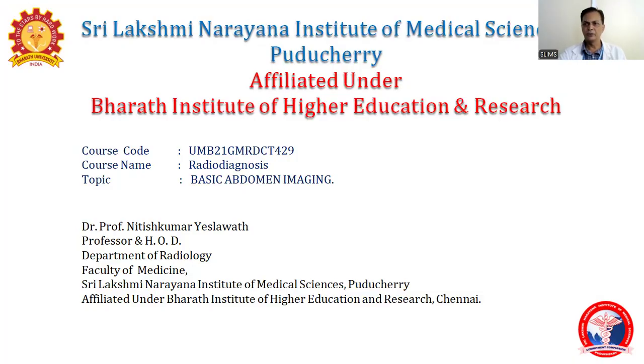I'm Dr. Nitish. Today we are seeing basic abdominal imaging. Here we try to reach the very basic and initial things in imaging of the abdomen for MBBS students. And here we'll go through basic abdominal imaging.